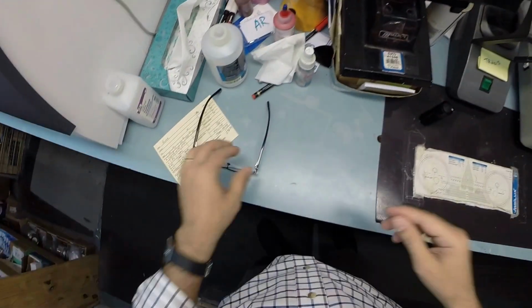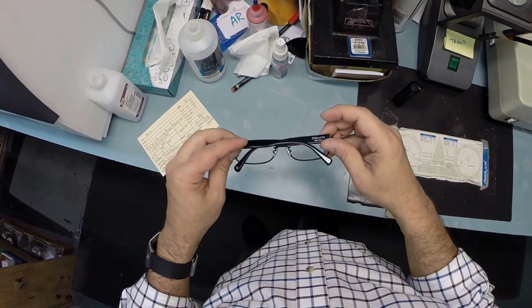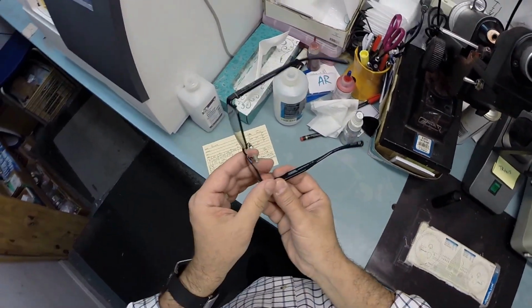Put mine back on so I can see what I'm doing. Flip them over, press down, there is no wobble. Close each temple to make sure they overlap perfectly, and they do. Check the tension on each spring hinge, that looks good. Now I'm going to go ahead and activate your lenses.